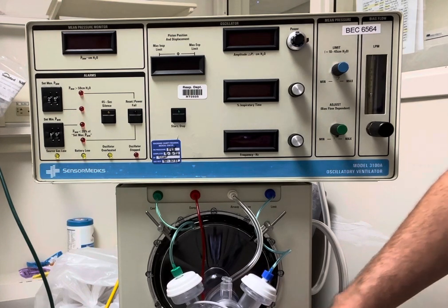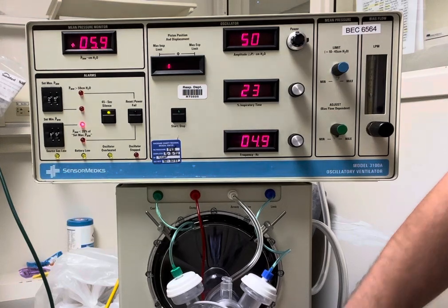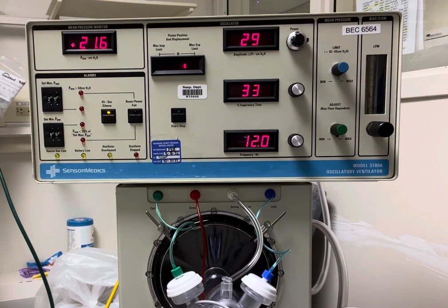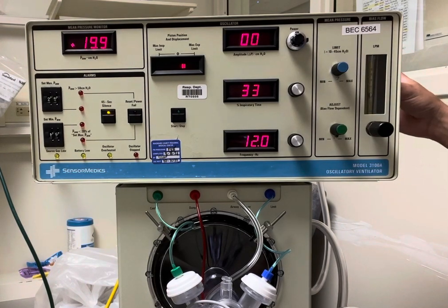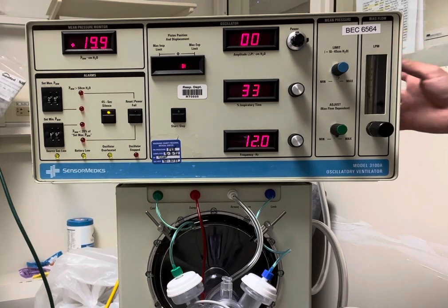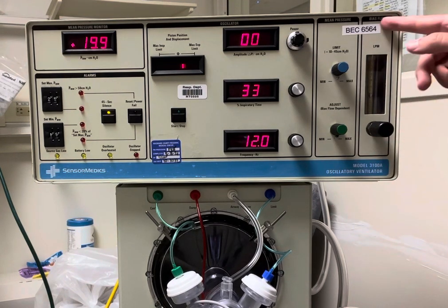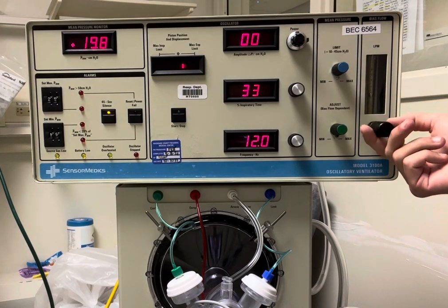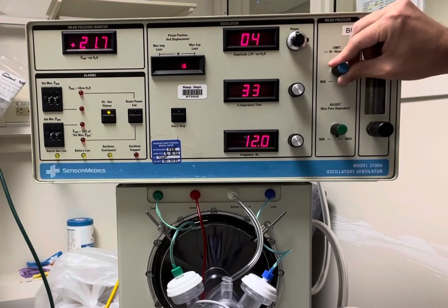Now I'm going to go ahead and turn the ventilator on, which is the power button on the front, and then look at the patient calibration checklist. What it wants us to make sure is that there's a green stopper in line, our bias flow is set to 20, and then our mean pressure knob limit is set to max.